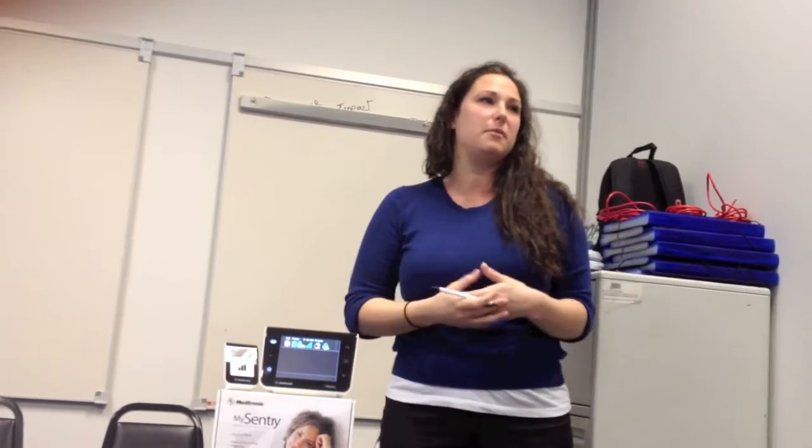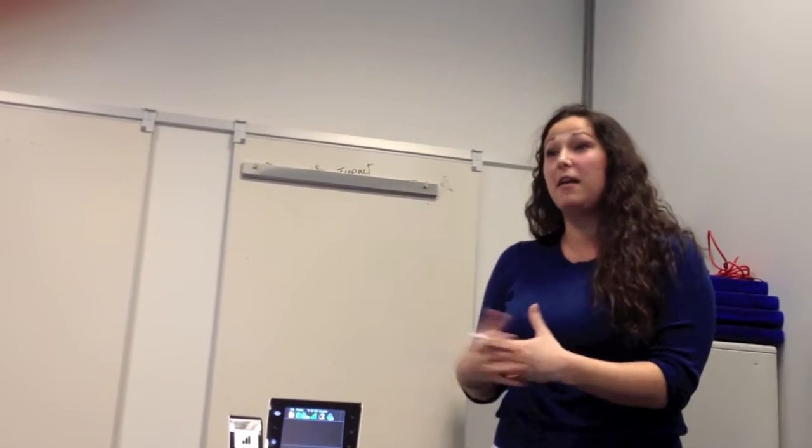This is something, definitely, take pictures of this, because this is a good one. Say you have it in the living room, or you're taking it with you, and you don't want people to see what's going on with you. You want to keep that private, to yourself, or maybe you don't want your child's to be seen. You can set this so you can still get all alarms and alerts and see what's going on from a general pump and sensor, but you're not sharing your glucose information that's being sent every 5 to 7 minutes. I think it's just great that you guys thought to do that.